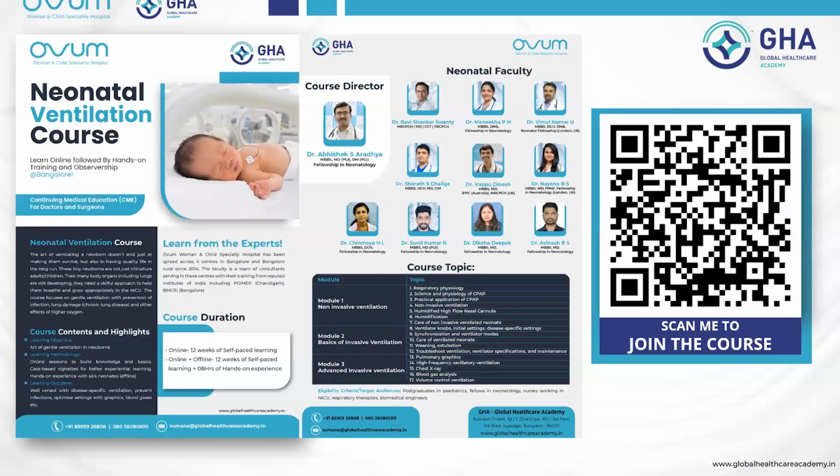There's a practical question: post surfactant, if you're delivering the same PEEP, is there a risk of pneumothorax? I think the answer is yes. So that is why you have to keep on monitoring the baby. And if the chest rise is good and retractions are coming down, you should start decreasing the pressure then. So don't wait for the baby to say that I don't need CPAP. We need to be sitting by the baby, and somebody needs to monitor the baby and see that the pressures are brought down once surfactant is given, and if retractions are less than 3 and saturations are above 94, 95.